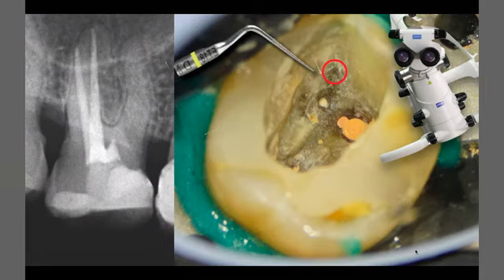Here is the MB1 and here is the MB2. Why? Because I have dark lines connecting the orifices. As we said, the floor map is the most important thing. Try to follow the dark lines and you will catch the orifice.